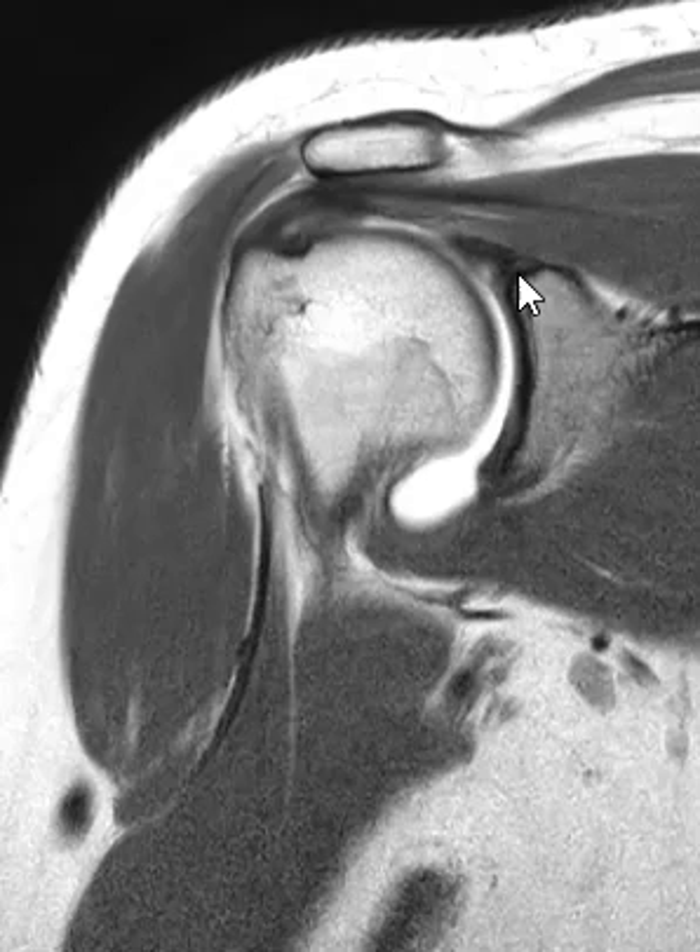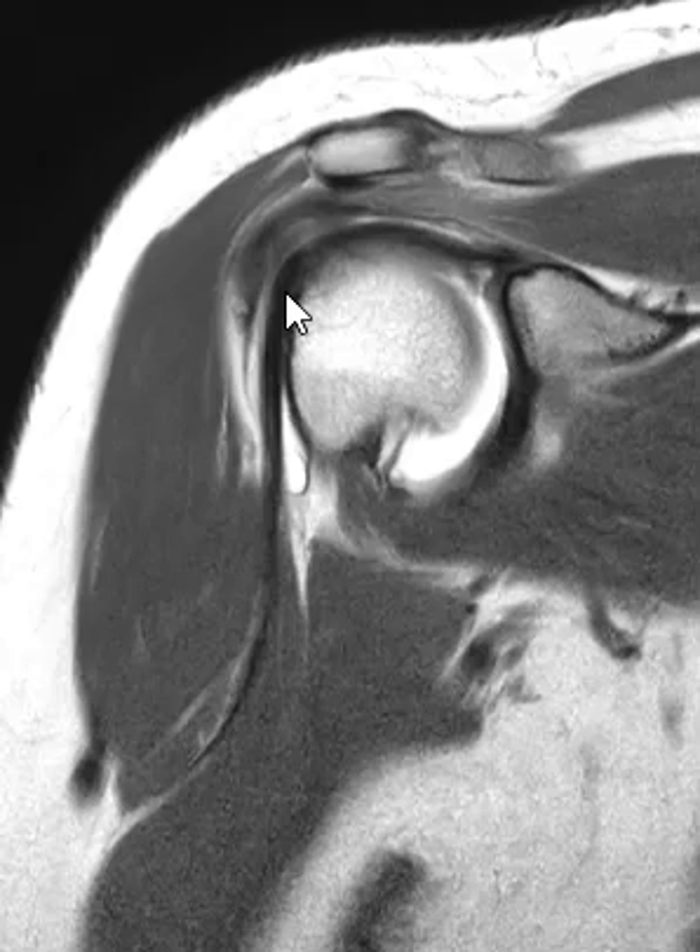Right here you can see it coming off. It goes over the top of the humeral head and then descends in the bicipital groove, coming down into the arm where it starts to turn into the muscle. Here's where you have the big juicy biceps muscle. So the biceps tendon goes up through the groove, makes a loop over the top of the humerus, and attaches over here on the cup called the glenoid. That is the proximal part of the biceps tendon.